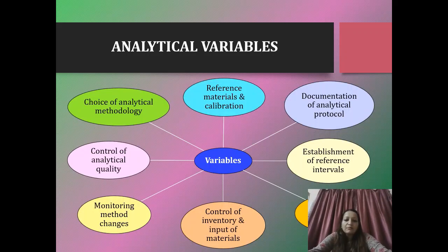So we come to various analytical variables that are part of the quality process. I am not discussing the pre-analytical variables, where quality assurance is very important, because this has already been discussed. So we will straight away skip on to these analytical variables.